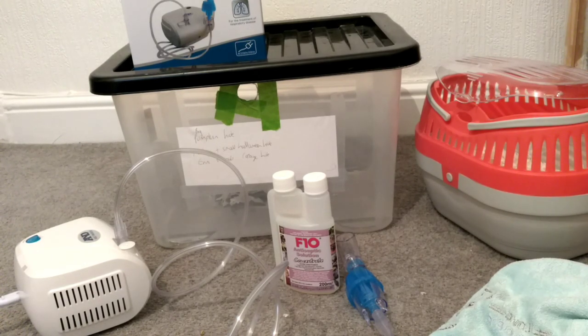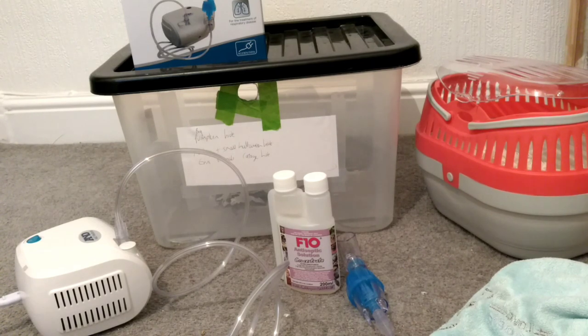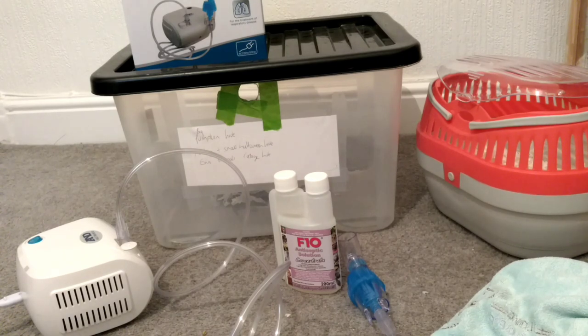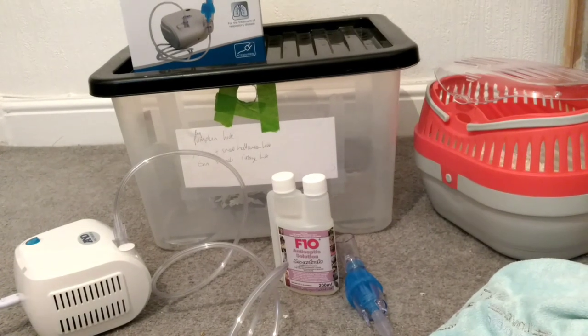I've been advised by the vets to try a nebuliser. I have seen friends use a nebuliser with their hamster but I never knew what it was for or how you used it. So this video is going to be all about that, because I was thrown in at the deep end and I thought this is surely going to help somebody else in the future and not be so stressed like I was.